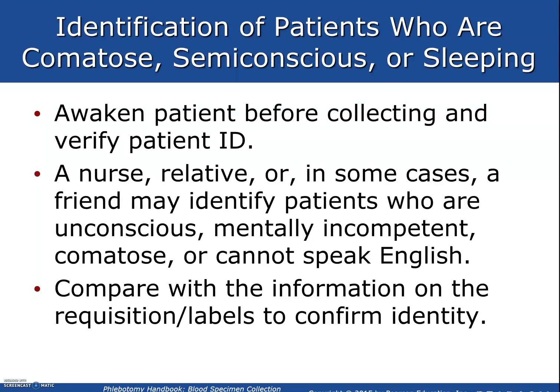Identification for patients who are comatose, semi-conscious, or sleeping. Awaken the patient before collecting and verifying patient ID. We need to have consent, which could be nonverbal, or what's called implied consent, where they just position their arm out towards you. In this circumstance, that is consent for us to draw.